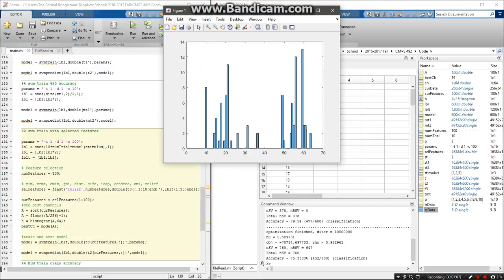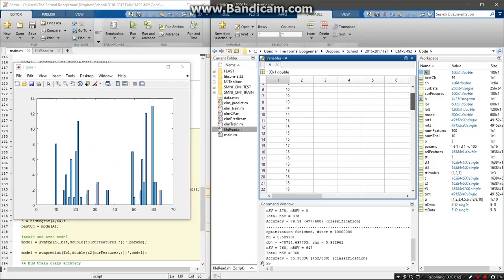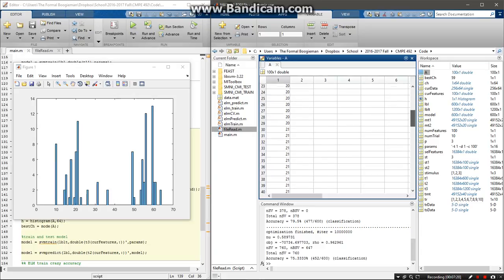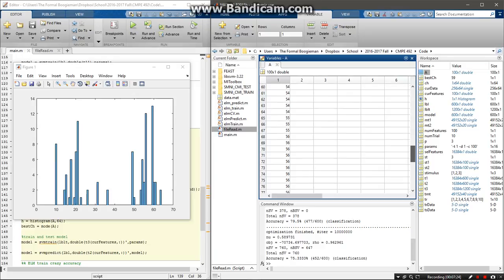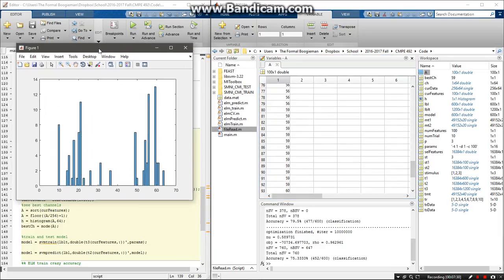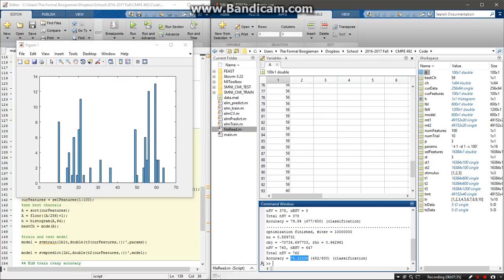As we can see, the histogram is displayed over here, and let's have a look which electrodes are representing data best. So 10th, 14th, 15th, 17th, as you can see, the list goes on. These electrodes or these channels represent data best, and we try to use them in training our models, but as you can see, they are not very efficient in classifying the data. Averaging over data is still the best option.